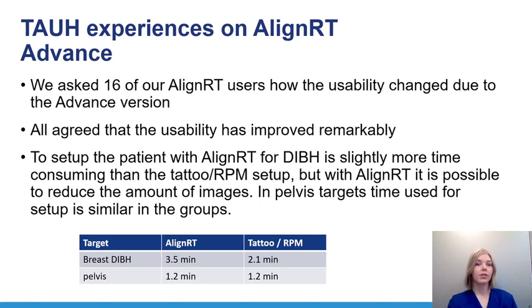Yeah, we measured the time used for the setup with AlignRT and with tattoo setup to compare these two. AlignRT setup for the DIBH is slightly more time-consuming than tattoo setup, and RPM.